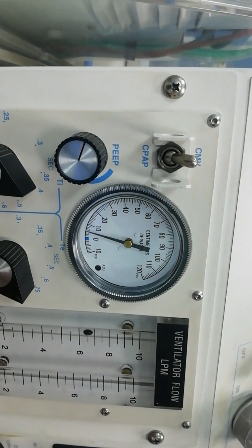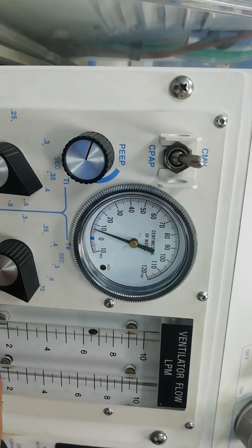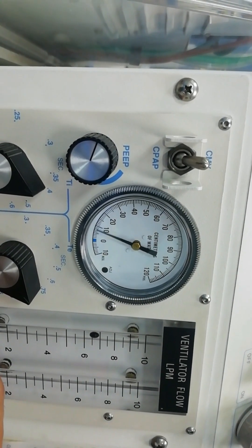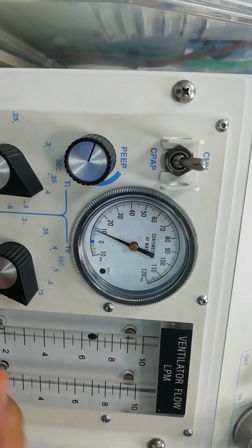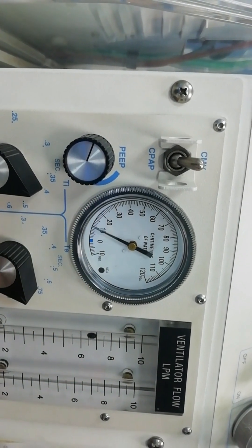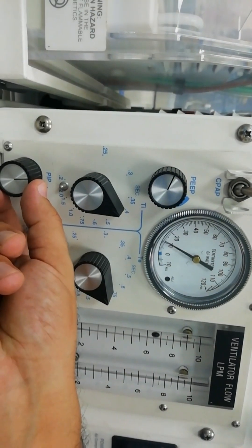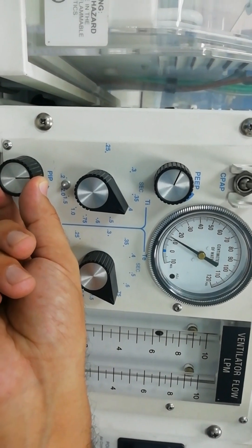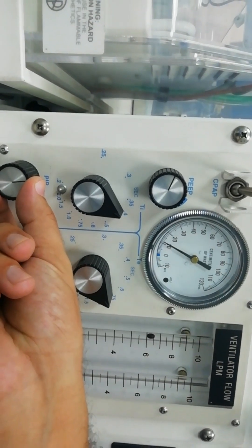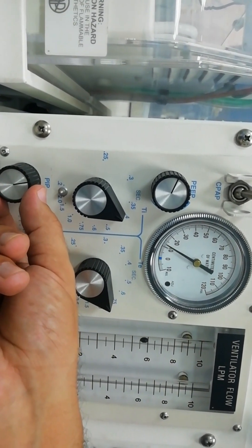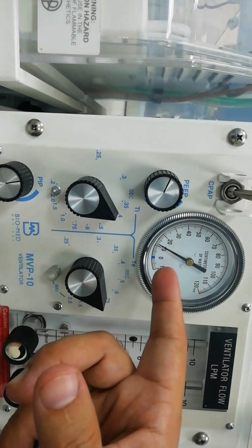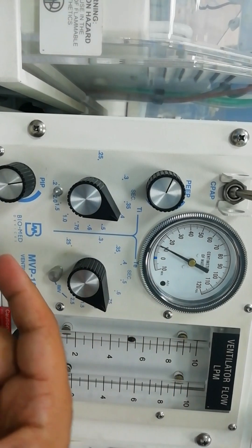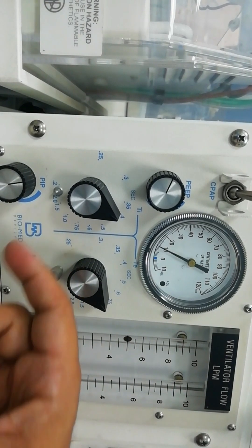And then we can increase the peak inspiratory pressure or decrease it according to our needs. We usually start at 12. You can see the gauge is pointing at 12.